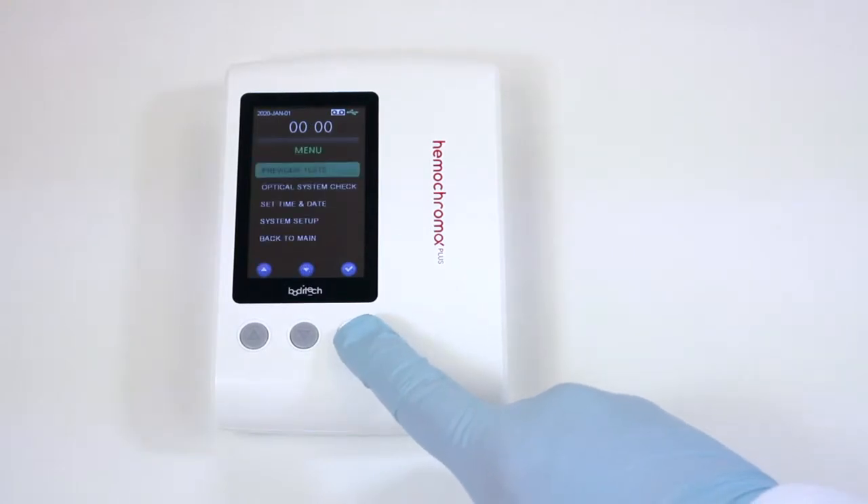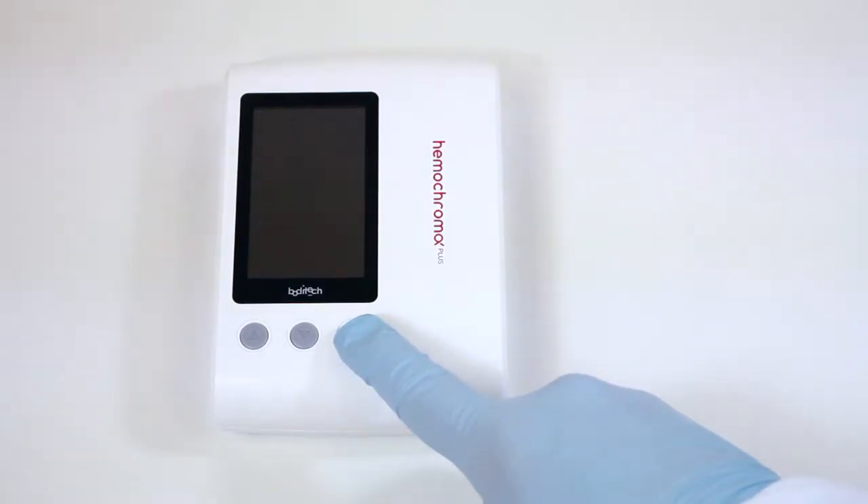To power down, press the Power On-Off button. The Hemochroma Plus Analyzer will power down.